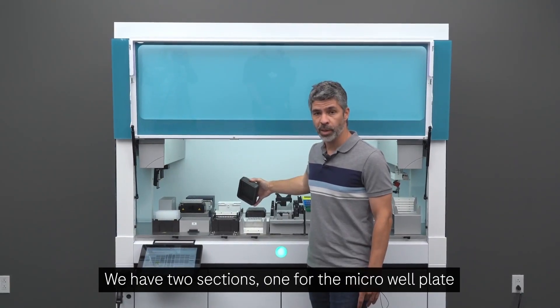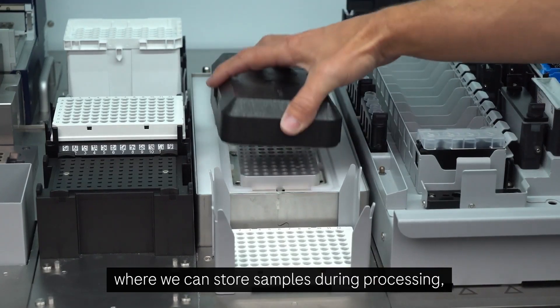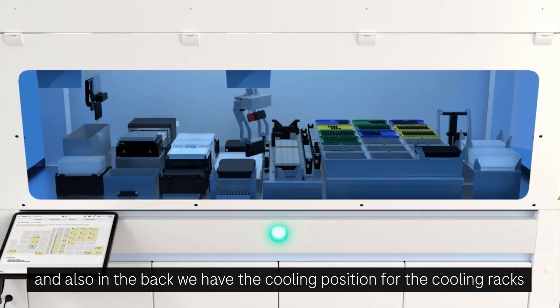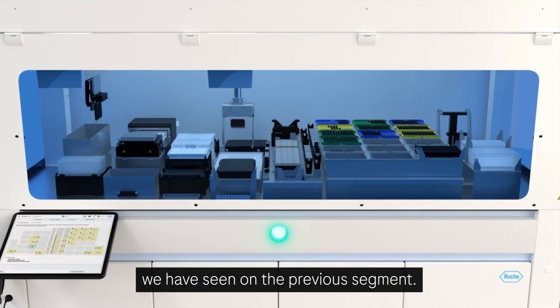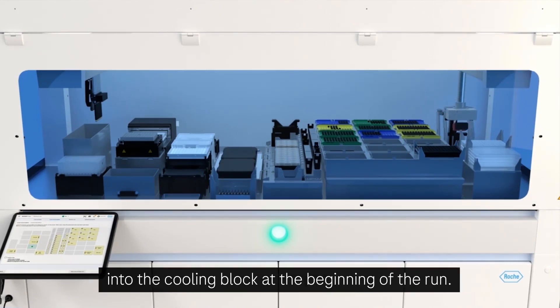One for the microwell plate where we can store samples during processing. And also in the back, we have the cooling position for the cooling racks we have seen in the previous segment. So the instrument will transfer those racks automatically into the cooling block at the beginning of the run.